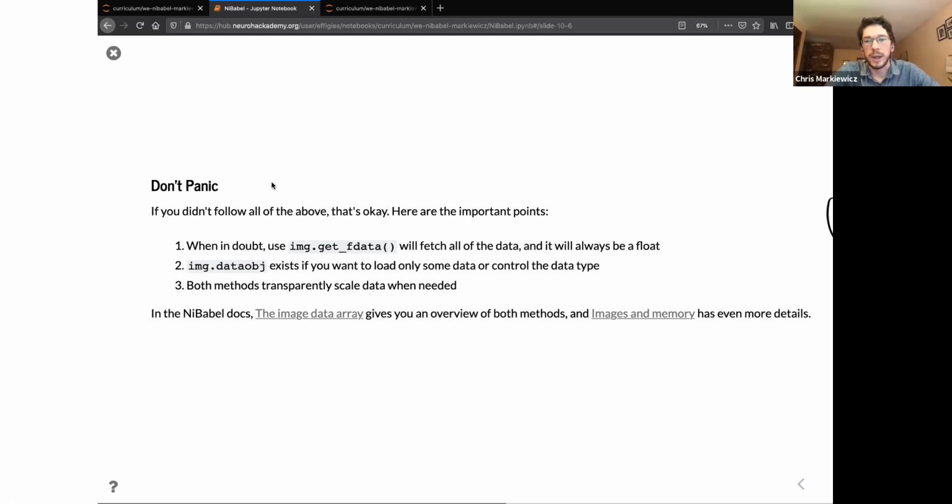When you get data off the scanner, it doesn't have 23 bits of precision. So even though you performed some mathematical operation and ended up with some values in those final bits, that doesn't necessarily mean they should be interpreted. It's like, if you go back to significant figures discussions from high school chemistry, you might get extra values in your result, but sometimes you just have to truncate them.